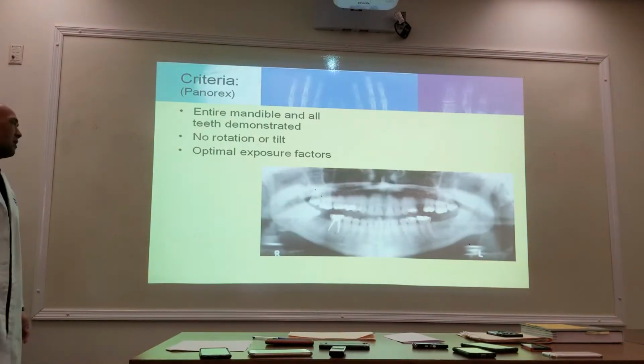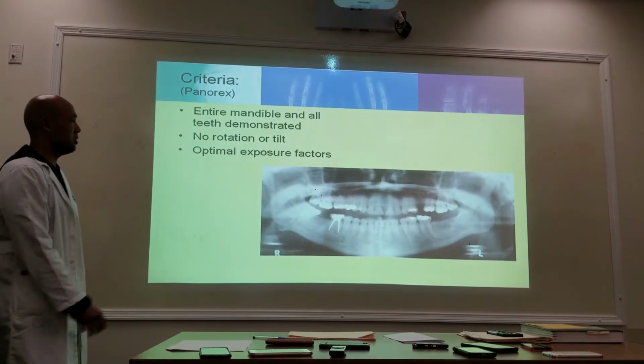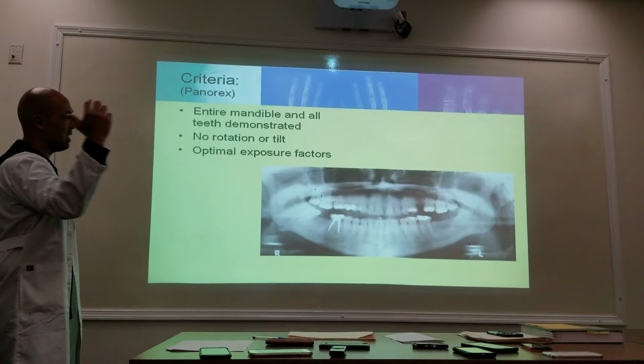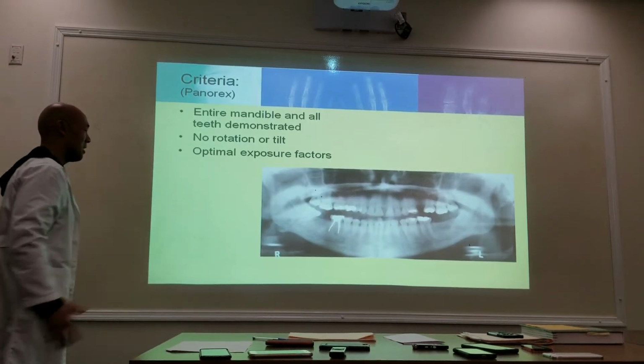And so you should have an exposure for the entire mouth. There's some blurring, because the X-ray tube is actually moving as it's taking an X-ray.